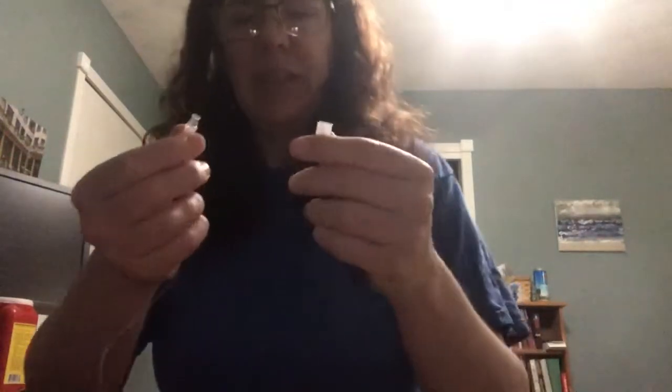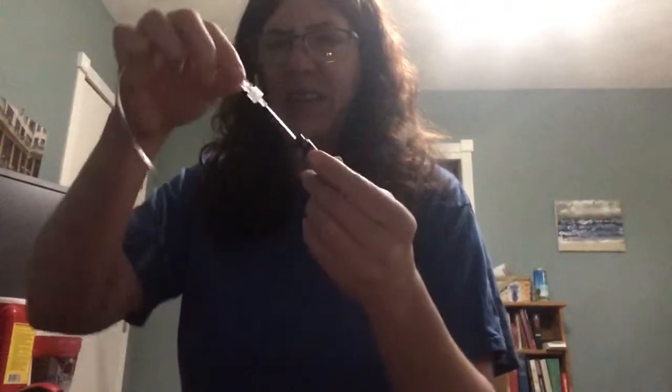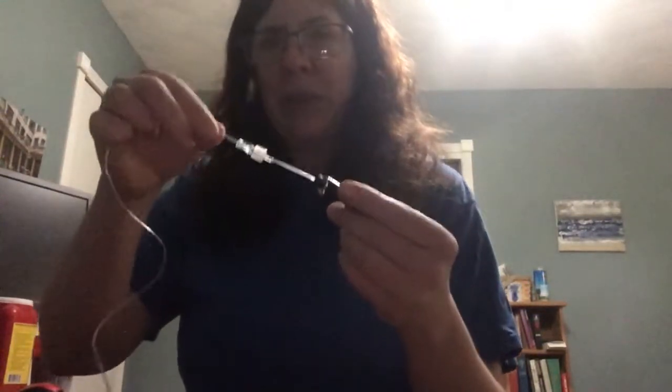So at this point, you want to take this part of the tubing, pop it into the luer lock, and kind of twist a bit. This is a bit that some people don't like on the T-Slim because it hangs off and it does make it look medical, but frankly, I just tuck it in. So I don't see it very often.